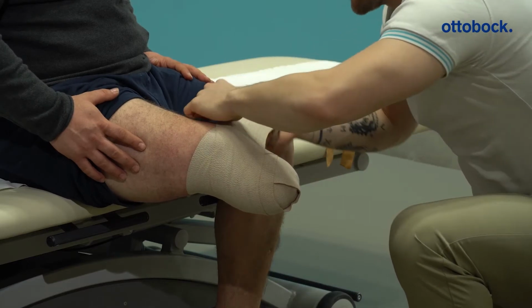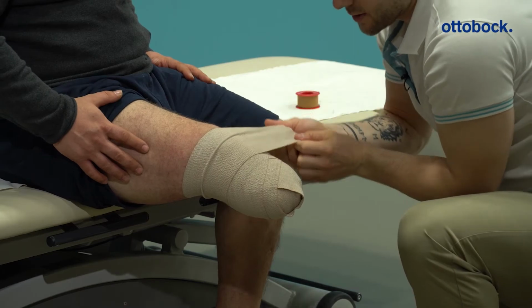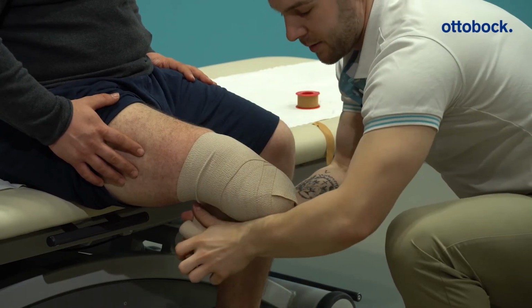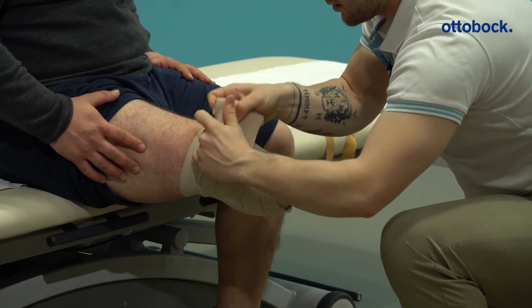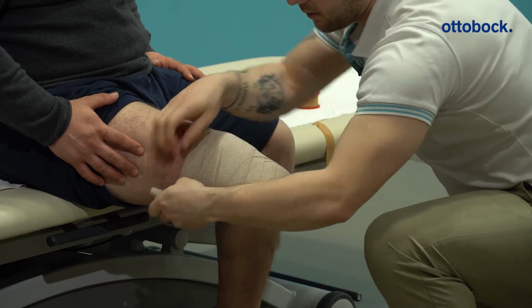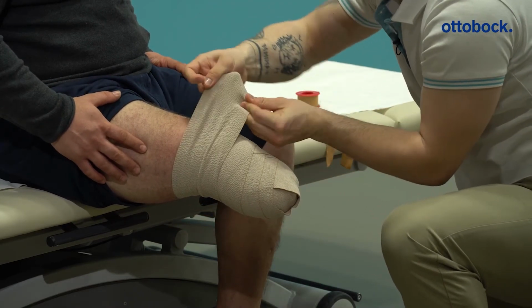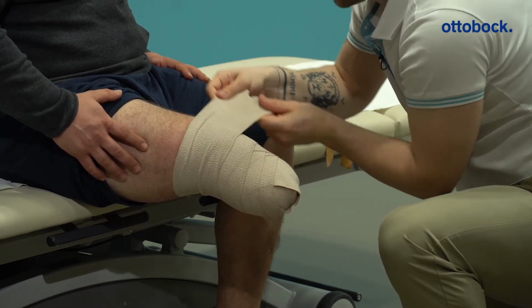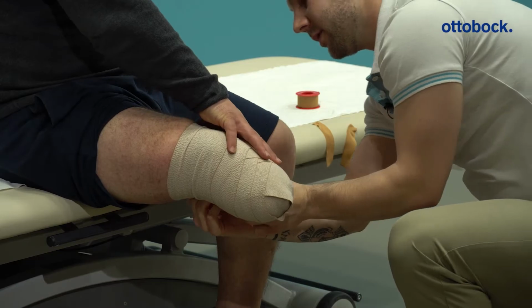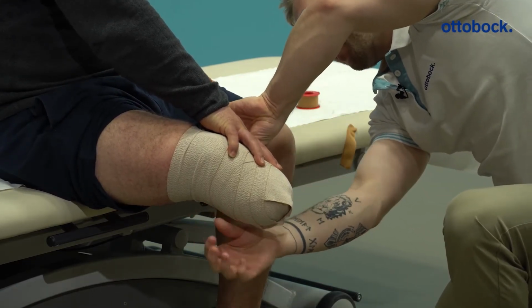And it's very important that the individual bandages are only used by experts like therapists or hospital personnel, because if you do it too high or with not a good pressure, or too high pressure in the upper part of the leg, it could also cause some damage. Then you hold it. Thank you. We'll fix it with tape.